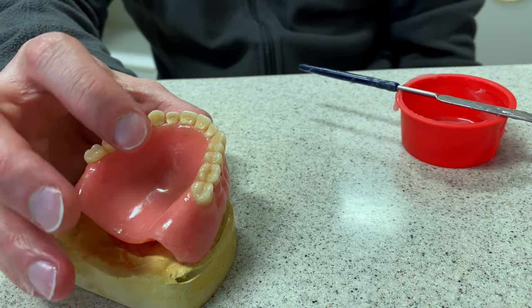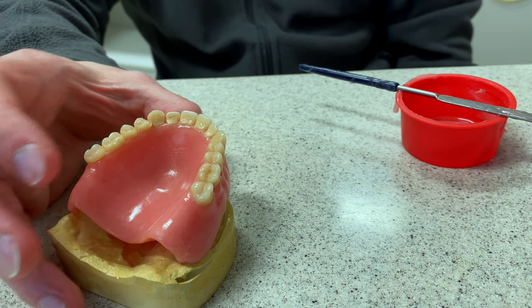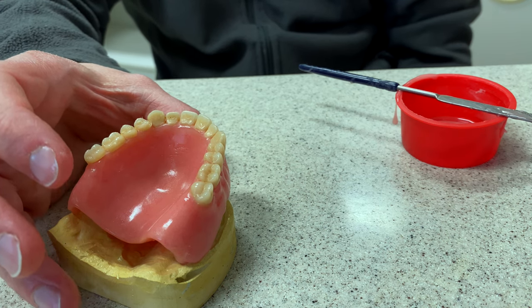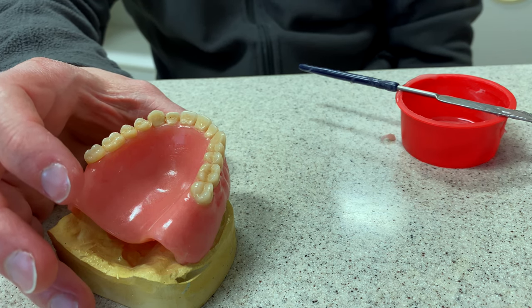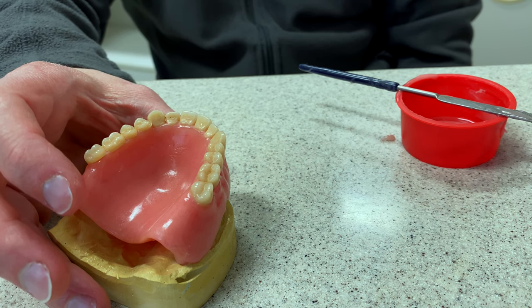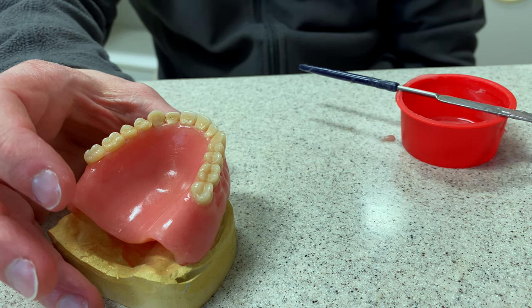After applying pressure for three minutes, the patient is instructed to open. We take it out, run it under cold water, remove the excess quickly, and then put it back in the patient's mouth for five more minutes with the patient biting down firmly — both the first three minutes and the next five minutes. After that second five minutes is done, we remove the extra, then give the denture to the patient and see how it works out. Again, this is a temporary measure — by no means meant to be a long-term solution, and by no means meant to last for three years as it had with that one patient.